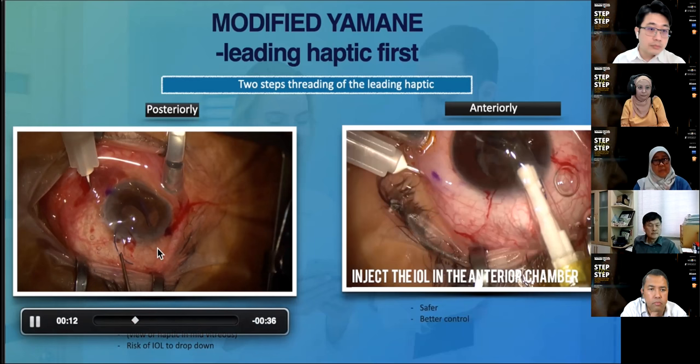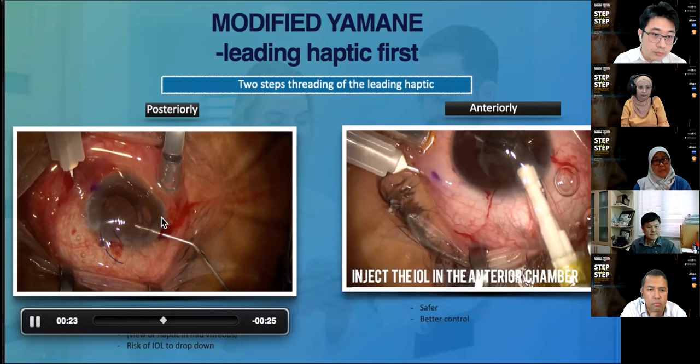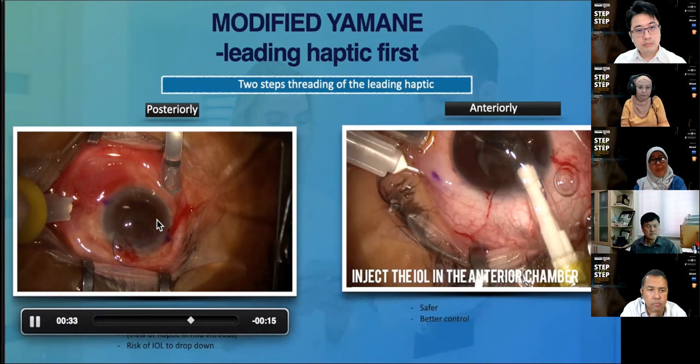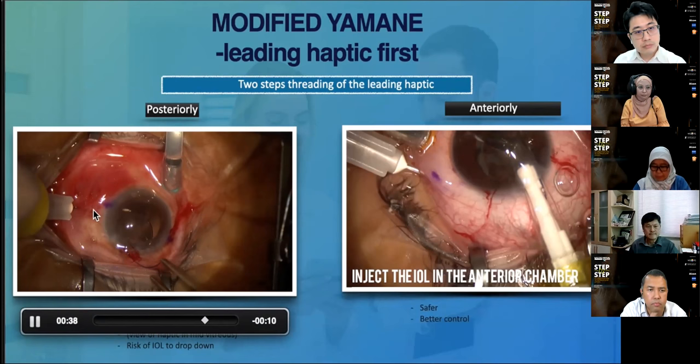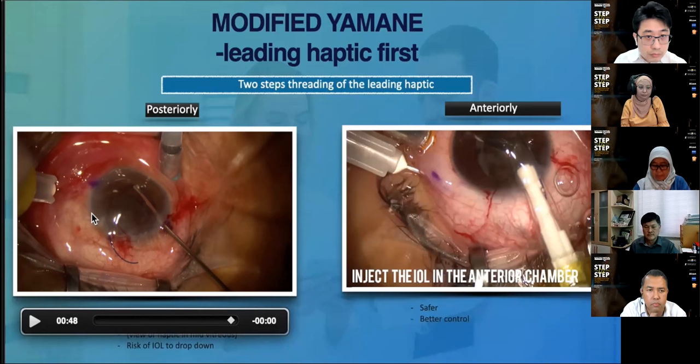One of the reasons why some surgeons like to do this is because you will have more space to manipulate the lens. Be careful that we need to ensure that the trailing haptic is always outside the eye so that we will not drop the lens inside the eye. Then only we will create the canal, create a tunnel, and use a forceps to thread the haptic into the needle. So that is one way of doing it.